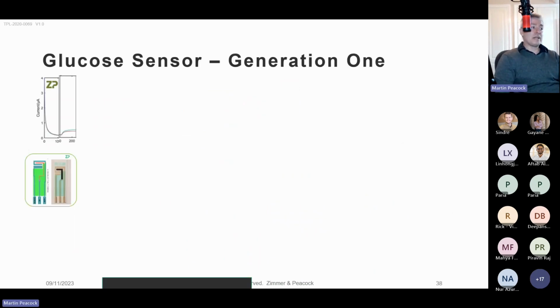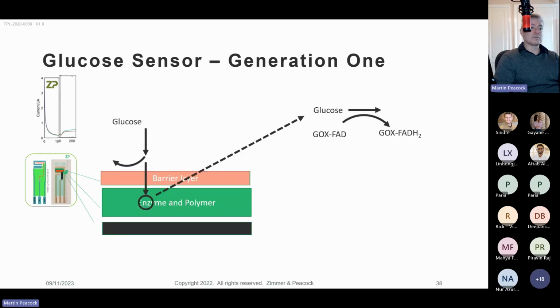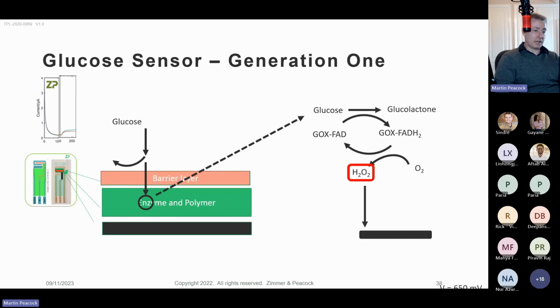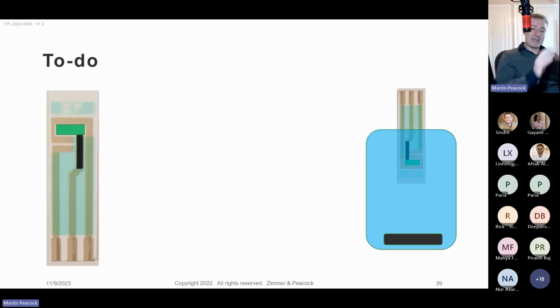Something that we'll talk about in a little bit as well is that I don't want to make this the glucose webinar, because I feel like glucose is a very commoditized technology. But Lynn will show you that, with just simple linear regression, even though we make glucose sensors and we test glucose sensors, in testing them we have a process. We structure our data. So we're ISO 13485, which means we have standard operating procedures.